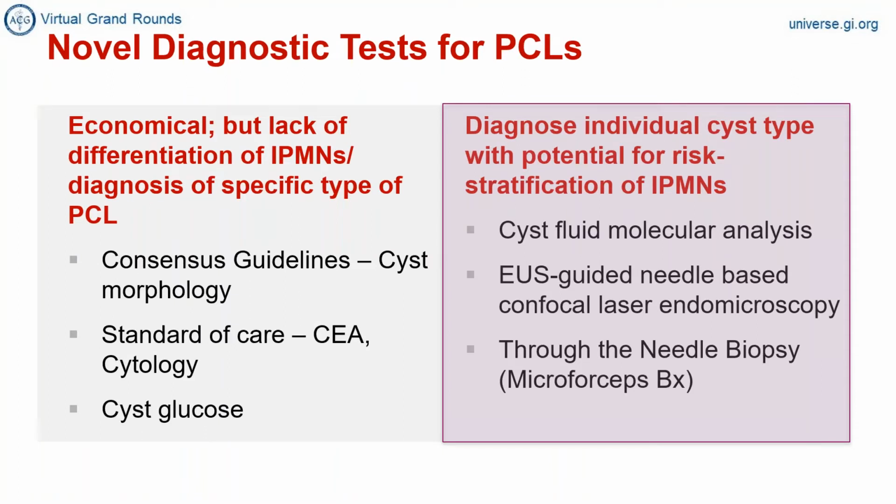So this leads to the second half of the talk, which is discussing these novel diagnostic tests. The three more common novel diagnostic tests include cyst fluid molecular analysis, EUS-guided needle-based confocal laser endomicroscopy, and EUS-guided through-the-needle biopsy using a novel microforceps biopsy.